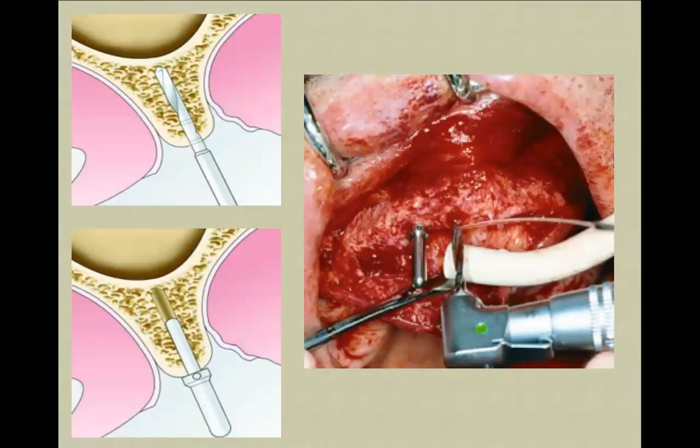You're making a measurement of the depth by special instrumentation, which exists in most of these implant systems. Is it 11.5? Is it 13? Is it 10? Okay, so you're sure, and you're placing a parallel pin. The parallel pin again is an instrument. It will indicate the direction of the first implant, so the second drill hole could be done absolutely parallel to the first one.